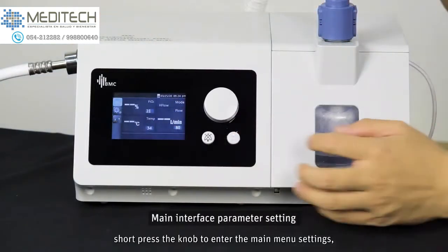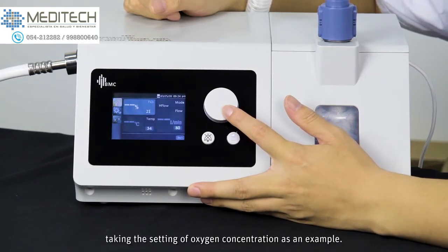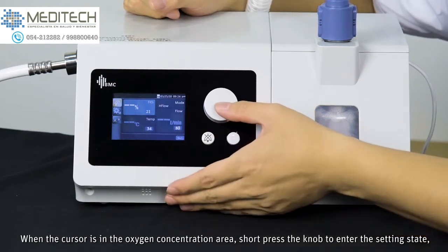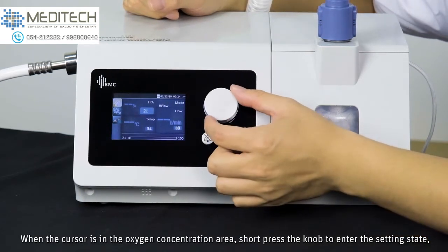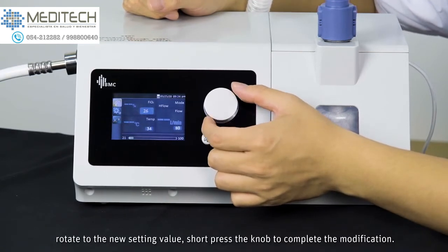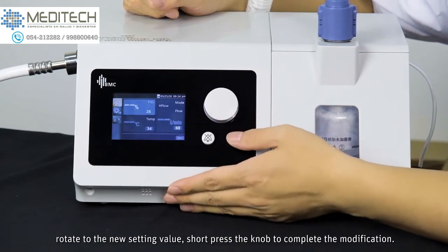Short press the knob to enter the main menu settings. Taking the setting of oxygen concentration as an example, when the cursor is in the oxygen concentration area, short press the knob to enter the setting state. Rotate to the new setting value. Short press the knob to complete the modification.